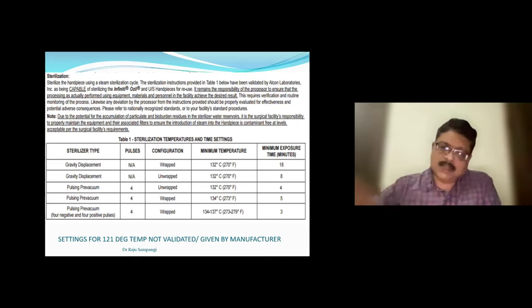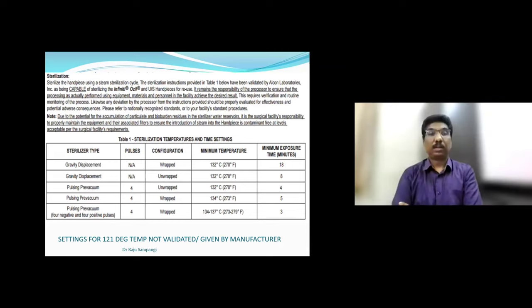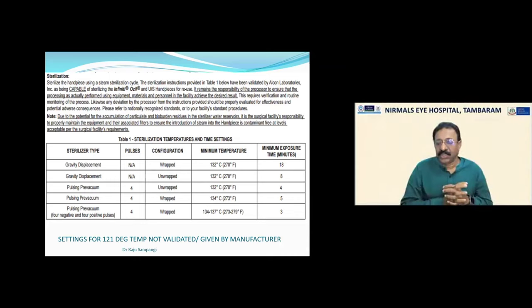So apart from NABH regulation, this is the main reason why it should be done. So can we take it as having these fully automated autoclaves, which also store the data and give you those printout? Is it better in terms of documentation? Yeah. It is just making your process easier.